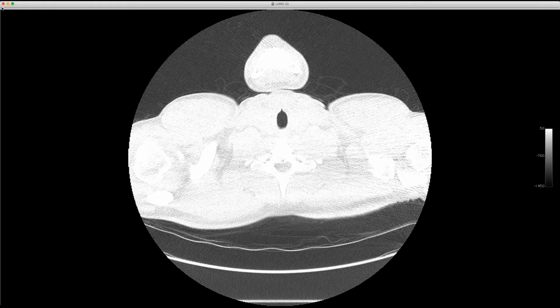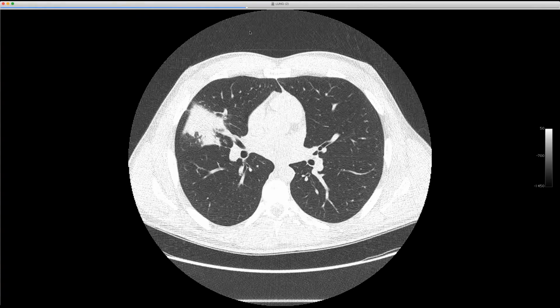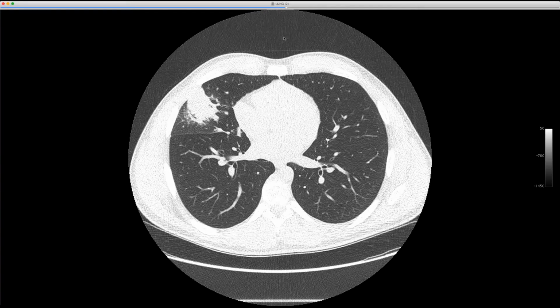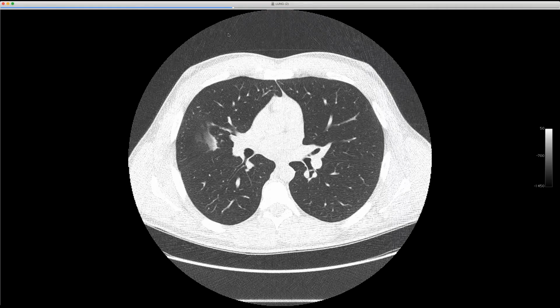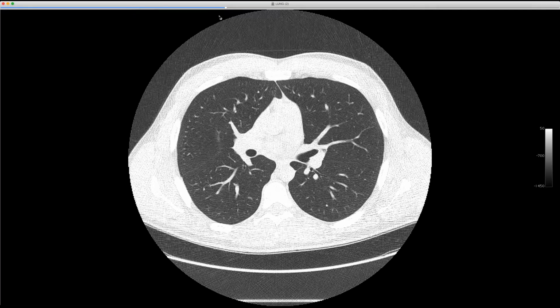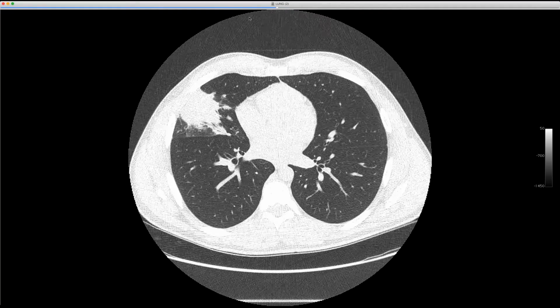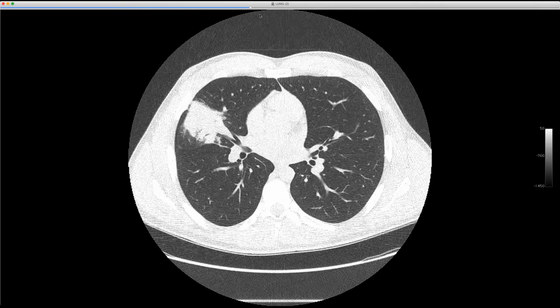I've shown plenty of cases of blasto, but just to illustrate the variation of it. This is more mass-like consolidation, and you do have some air bronchograms, but you sometimes lose them. And then there's some small nodules around it. Nothing particular about this case says blasto other than the history. The lack of pleural effusion is notable; with bacterial infections, especially if it's been going on for a while, we'd expect to see pleural effusion, and they often have some lymph node enlargement. And this guy does not.